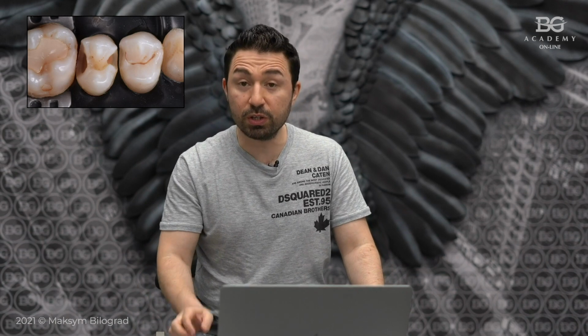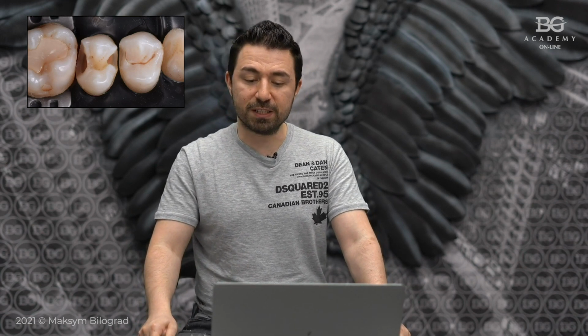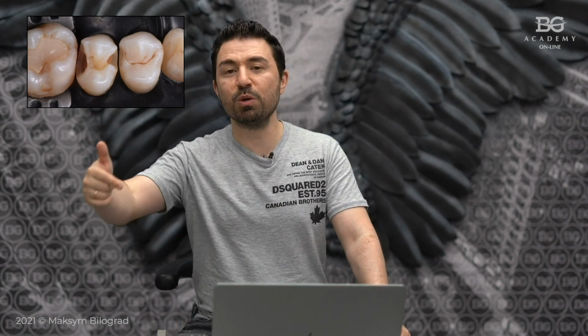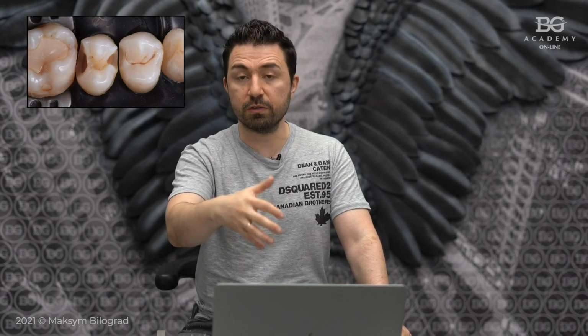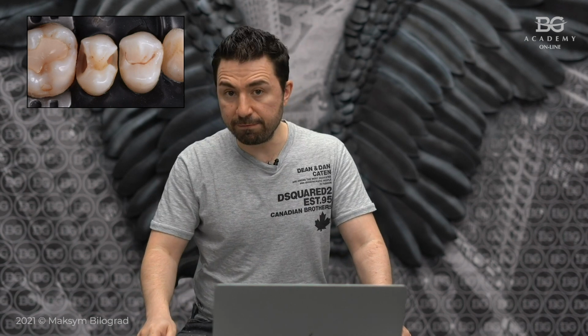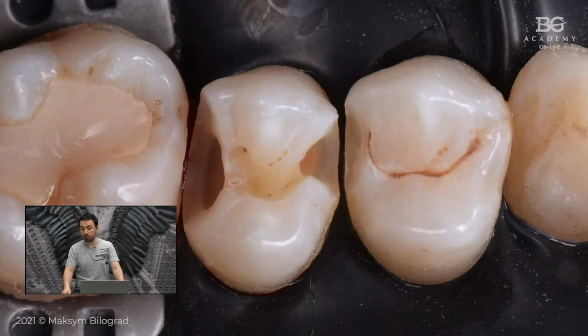Before I continue explaining and showing you things, I would like to ask you a question, and I also have a small request for you. Answer this question first, then you will watch the video. So the question is, considering the necessity of veneering for these premolars and the caries defects that we have, what type of restoration would you go for? We need to cover the premolars from the vestibular side, and we also have caries defects.